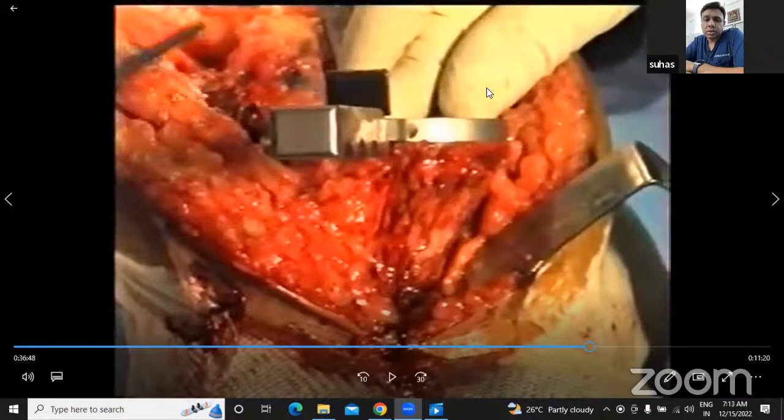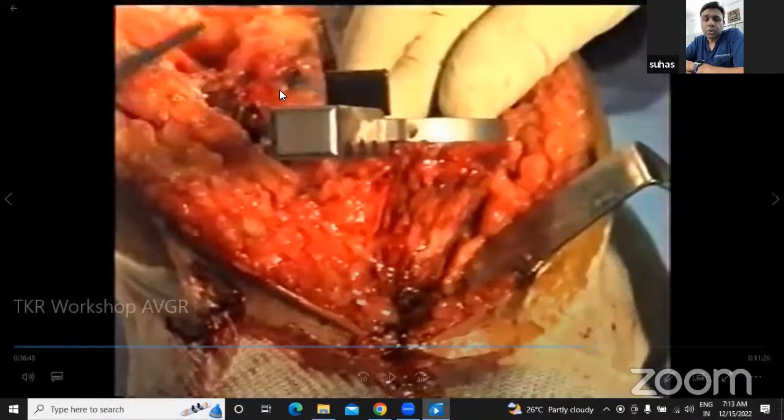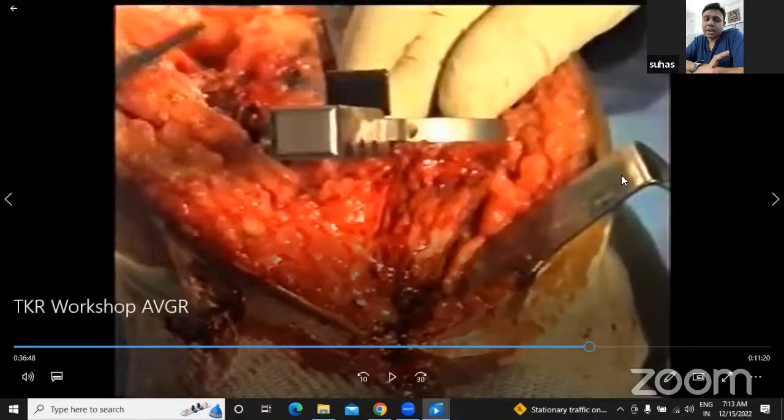But based on the pathology, you will have to decide whether you want to cut more bone or less bone. Usually, the decision is to cut less and how less. So from 8, maybe you want to cut 6 and then make sure that your gaps are okay. Otherwise, you can always go back and take an extra cut. So always try to be a little conservative in terms of the amount of bone you're removing, because you can always go back and cut more. But if you already take more bone and you perpetuate lateral laxity, then it's very difficult to come back.